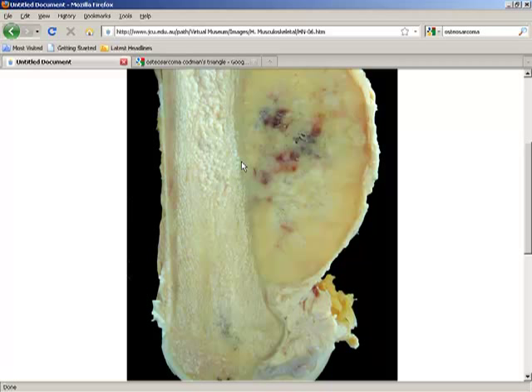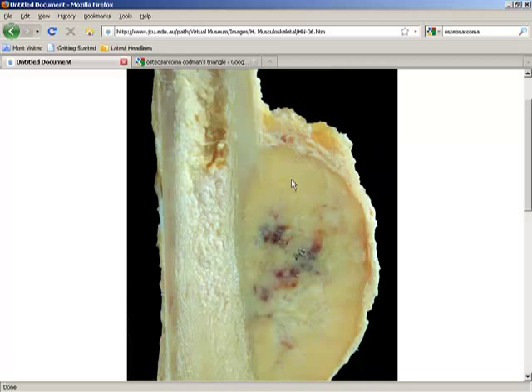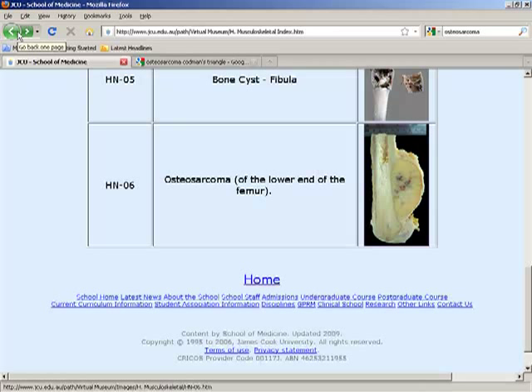Okay, so this was diagnosed as osteosarcoma, and osteosarcoma can show areas of hemorrhage, necrosis, especially when it is massive, big, and usually in the center, compromising of blood vessels. That's again osteosarcoma. So osteosarcoma is the most common.